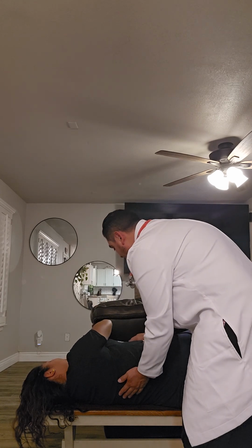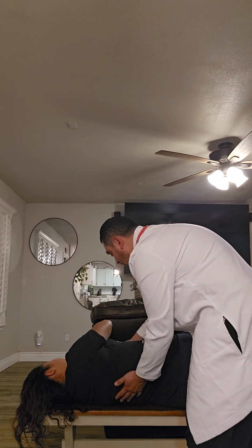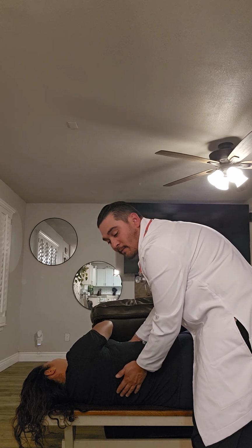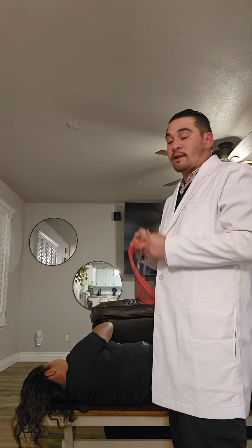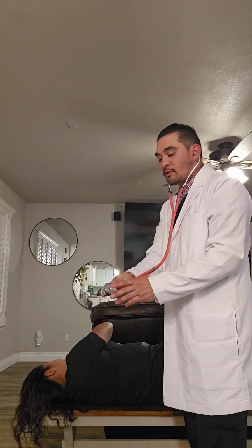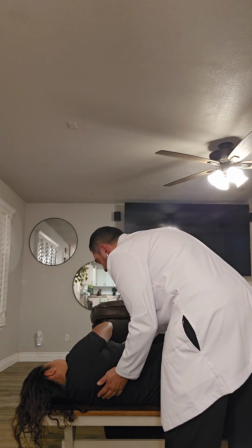So at this point, I'm looking, and I do see a little pulsation in this area. And the landmark would be the 5th intercostal space. I'll also take the time to listen to her heart sounds. We're going to start at the PMI. With the diaphragm, I'll apply some firm pressure so that I'll be able to hear the heart.